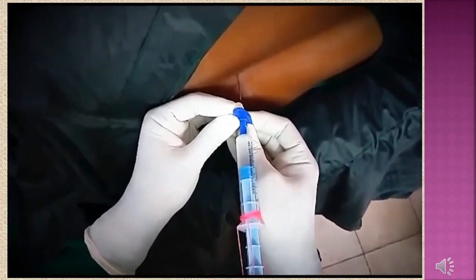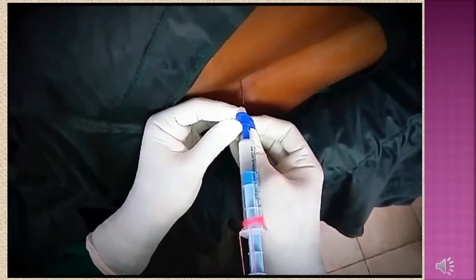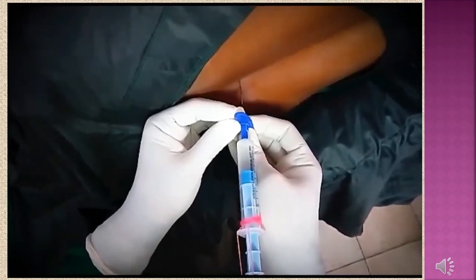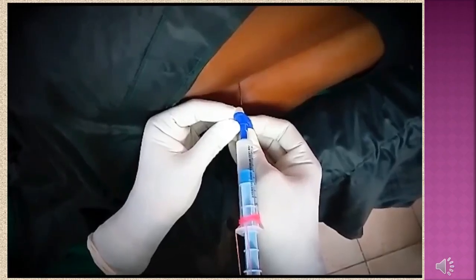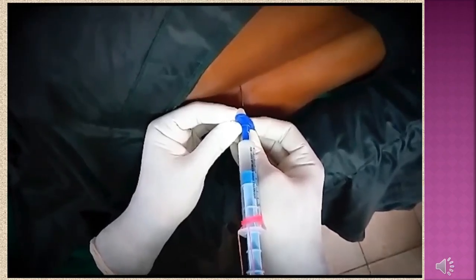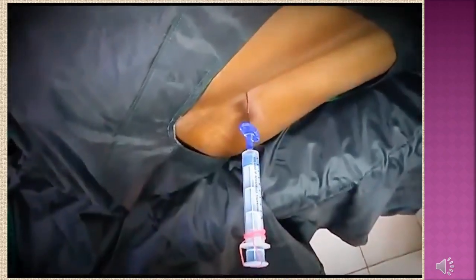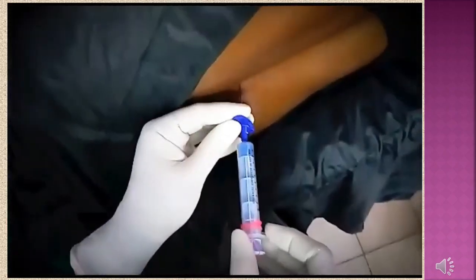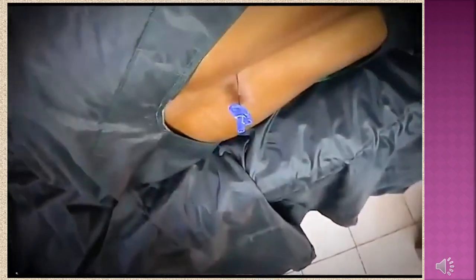Now the syringe is advanced with the help of both hands, because both hands are used, so there is a lot of control over the needle. As soon as the space is detected, we can see the saline gets sucked in. Thus this is an objective confirmation of the epidural space.